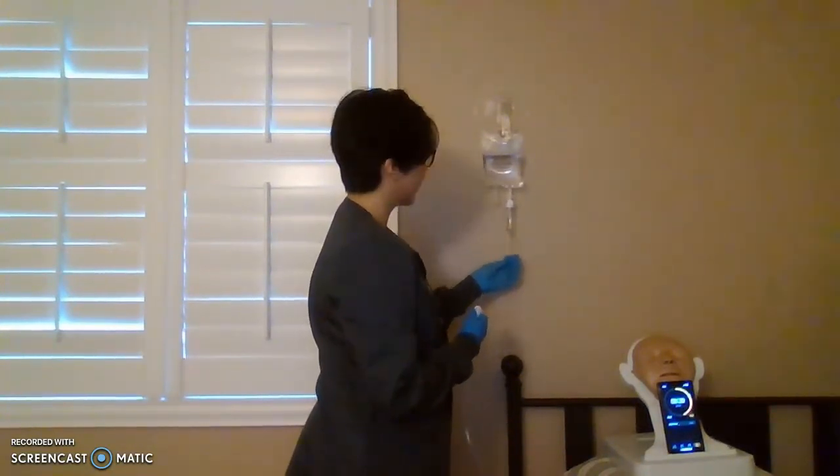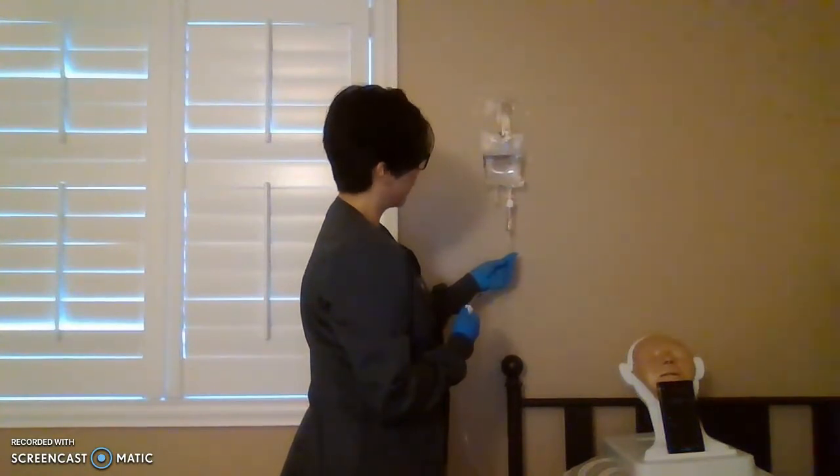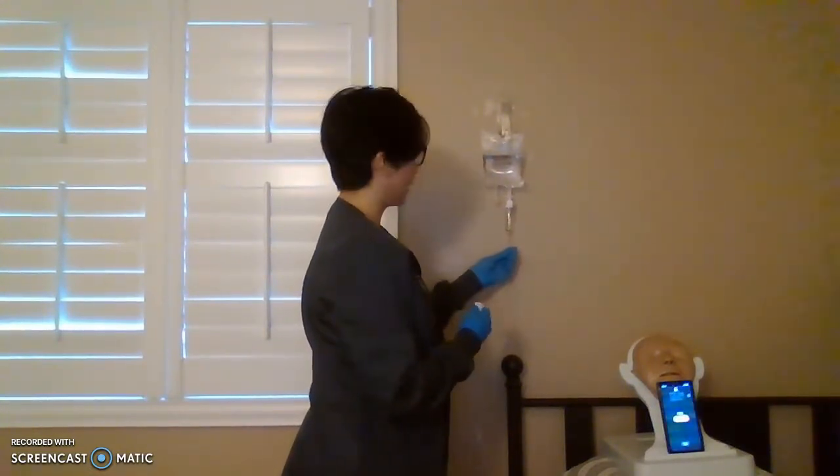Okay, we are regulating. 27, 28, 29, regulating, 30, 31, 32, 33, 34, 35. We are regulating still slowly, 36, 37, and 38 drops per minute.